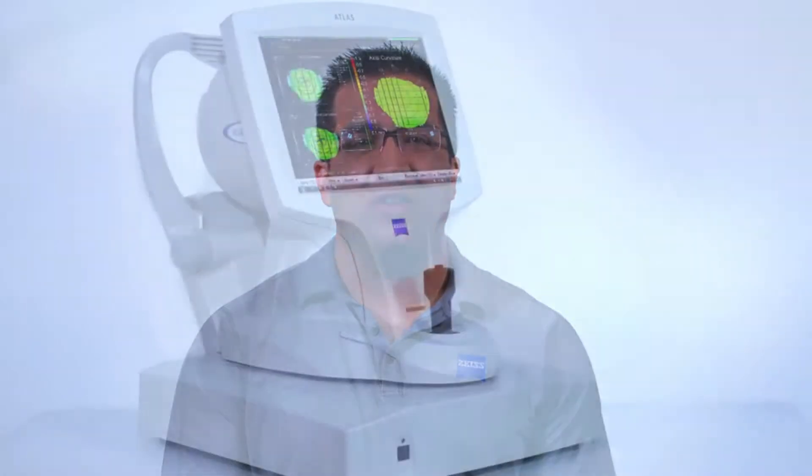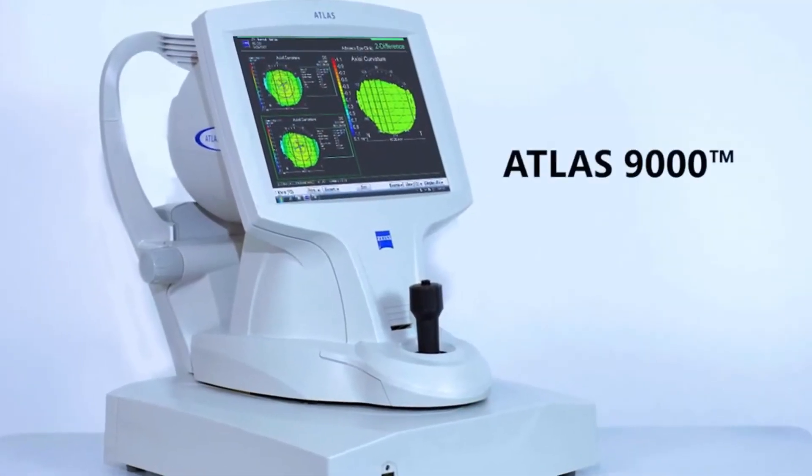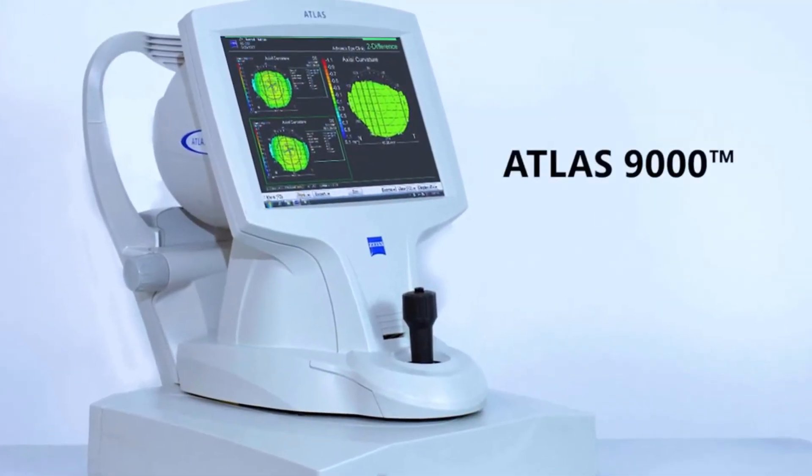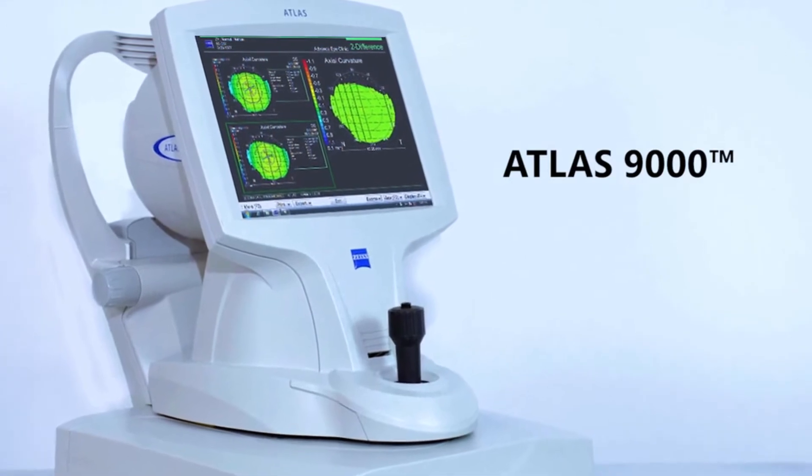Welcome to Zeiss Quick Help. I'm John, Senior Technical Support Engineer at Carl Zeiss Meditech. Today, I'm going to show you how to change the views or create a customized topography map on an Atlas 9000.